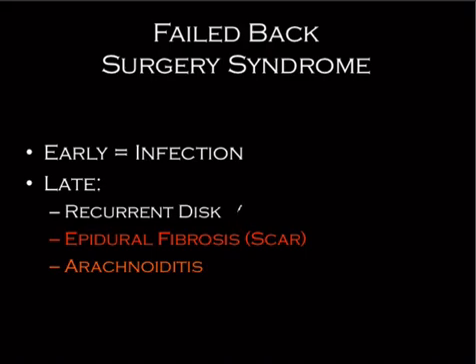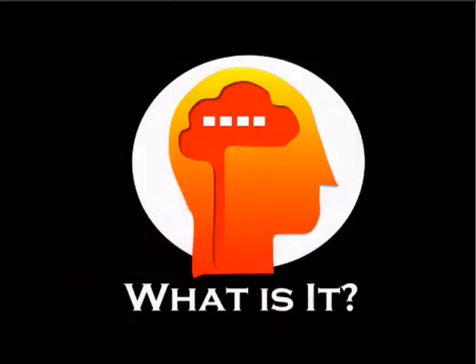So remember that I said distinguishing between these 2 is the reason you give GAD, and that the scar will enhance and the disc will not. Arachnoiditis is going to be shown as clumping of nerve roots, but I would bet you that it was more likely to be shown as the empty sac sign.